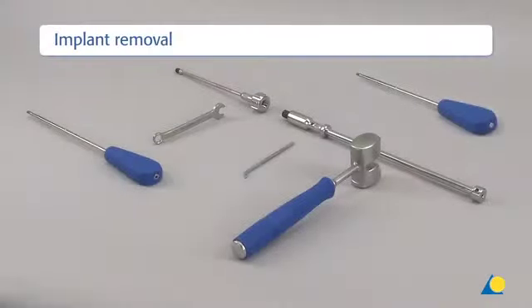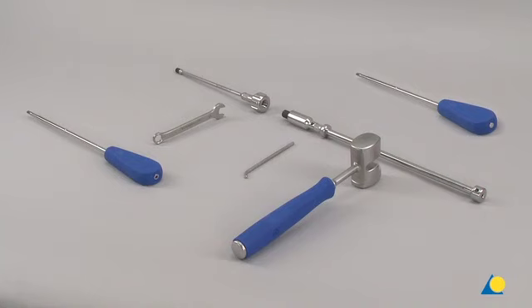Clinically, implant removal is an optional procedure. The instruments needed include the screwdriver, star drive T40 with spherical head, cannulated, length 330 mm, the extraction screw for tibial and femoral nails, the combination wrench, 11 mm diameter, the hammer guide, the pin wrench, 4.5 mm diameter, the screwdriver, star drive T25, self-holding, length 330 mm, and the combined hammer.